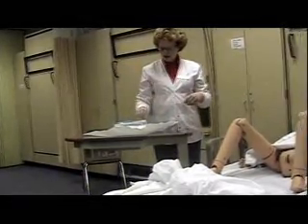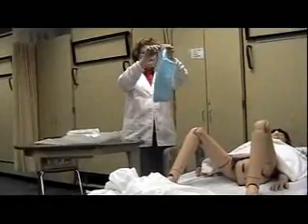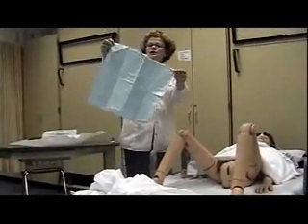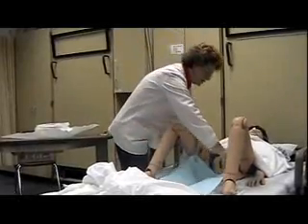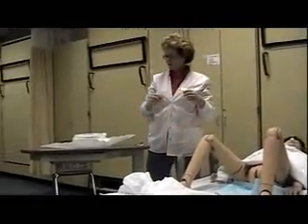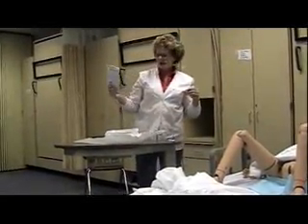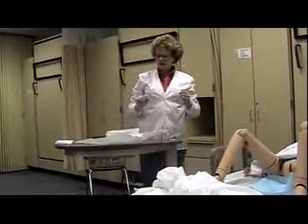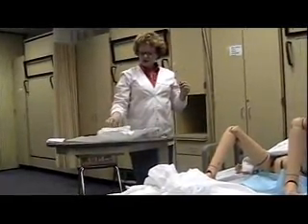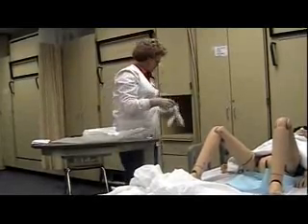The first thing you want to do is pick up the blue cover and place it underneath the patient, touching only the corners so as not to contaminate. Mary, can you lift your hips up a little bit? Your sterile gloves are next — take these out and set them aside for now. The next drape is a fenestrated drape, and we no longer use these for males or females, so just set it aside or discard it.